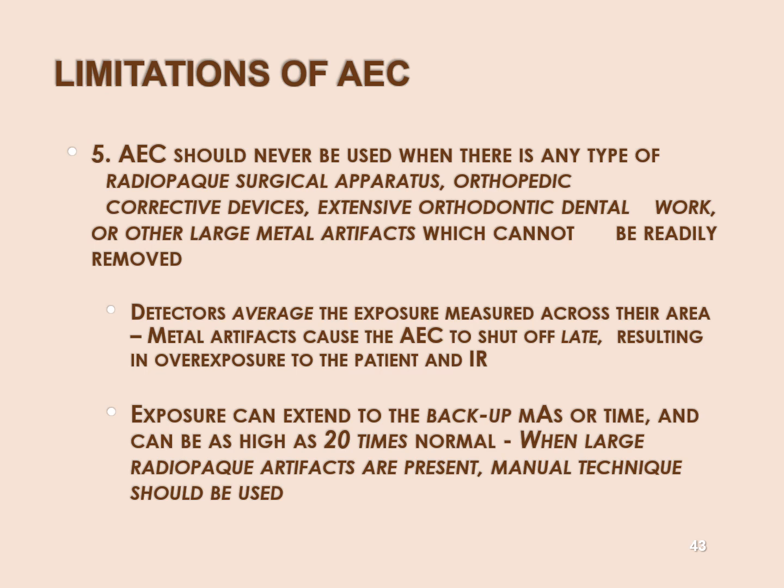AEC should never be used when there's any type of radiopaque surgical apparatus. Artificial hip, that's a big chunk of metal. So if they have an orthopedic implant, that's a big chunk of metal. What is the AEC actually measuring? Is it counting exposure time? No, it's counting ionizations.